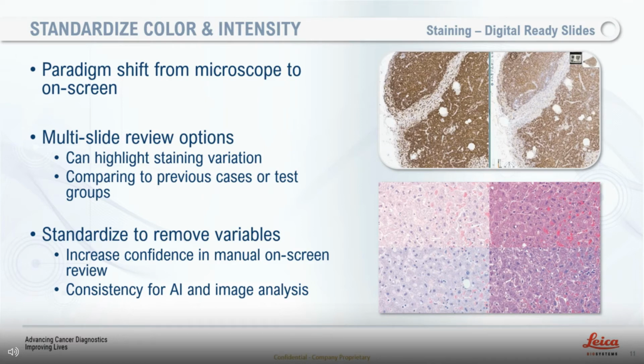By standardizing your staining, you're going to remove one of those obstacles that need to be overcome as you're moving towards on-screen review.